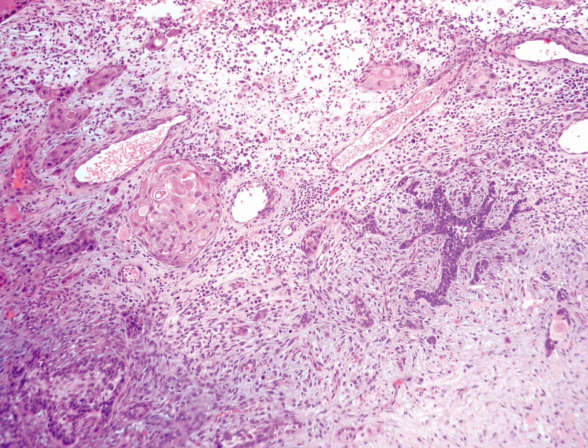This is another image showing a high-risk variant known as the basosquamous carcinoma, which is characterized by two highly atypical components, the basaloid strands admixed with highly atypical squamous cells.